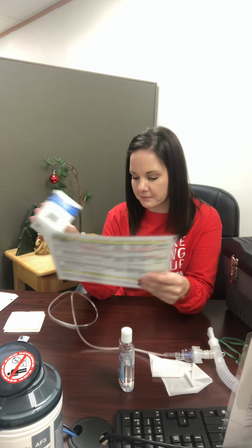We have an albuterol sulfate nebulizer solution. It's 1.25 milligrams per 3 ml unit dose vial. We're going to give 1 vial via nebulizer every 4 to 6 hours as needed for asthma. Our monthly medication record, this is for Joey Doe. It's an albuterol sulfate nebulizer. We're going to give 1 dose vial by nebulizer every 4 to 6 hours as needed.